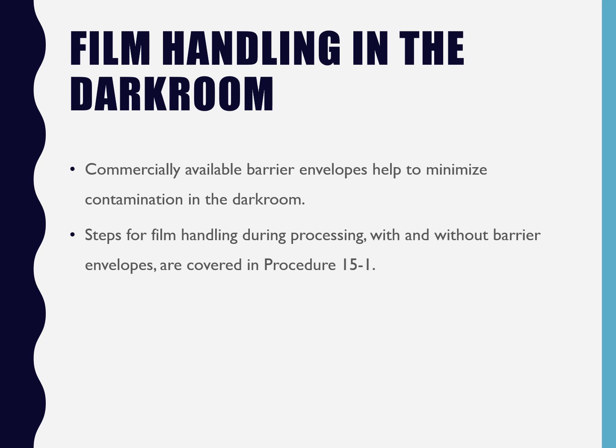If you look at procedure 15-1, that's on page 140, right on the opposite side of it, you can see how it talks about processing those films with those barrier envelopes and then how to process those films without the barrier envelopes. For the purpose of our clinic, I know some of you have already taken, well, all of you should have already taken, at this point, I'm recording this lecture ahead of time. You would have already taken those radiographs. We did things a little bit differently than the way that the book describes it because we didn't put this in anyone's mouth. I have a couple of other reasons why we did it the way that we did.